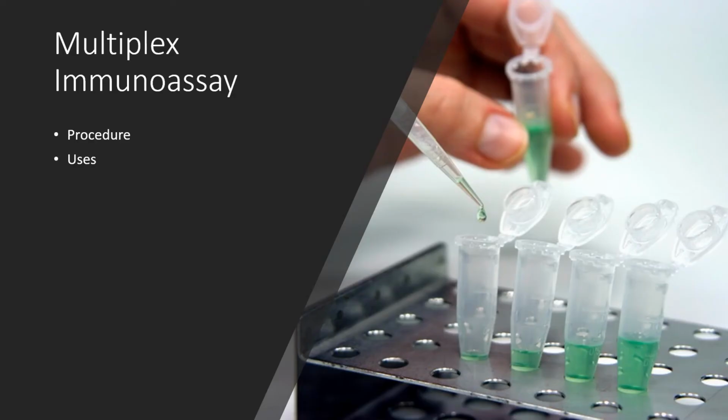Multiplex immunoassays, or MIAs, are the third and final type of ANA testing. They use magnetic beads to simultaneously measure multiple analytes in a single experiment. Beads of specific fluorescent colors are coated with antibodies with specific binding circumstances and mixed with the subject's blood serum. The number of analytes measured is determined by the number of different bead colors.